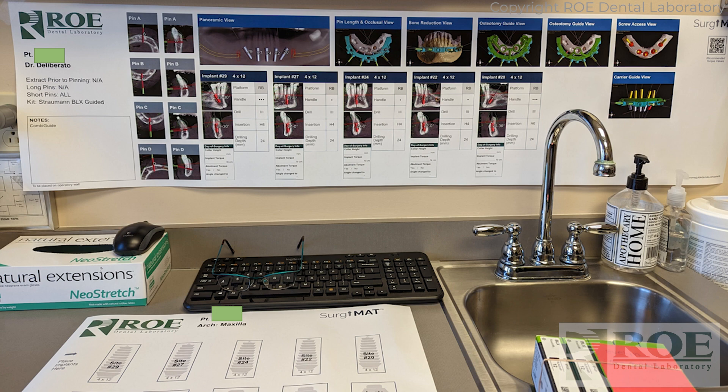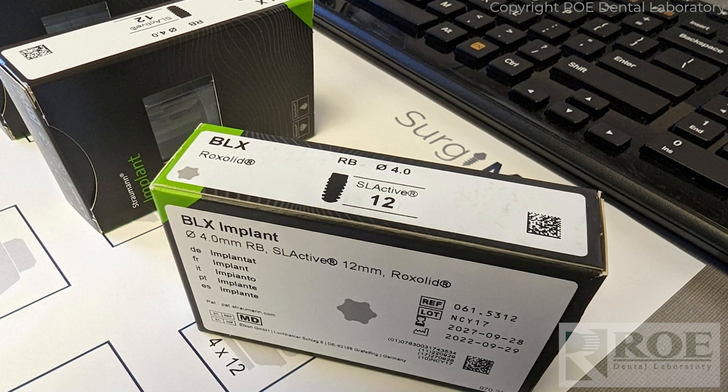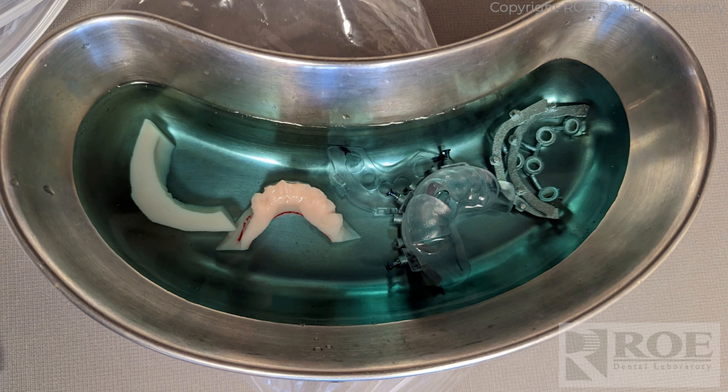The SurgyMat gives you a panoramic view and all the images of the guides and how they relate to the bone, the drilling sequence, and an area to track torque values during surgery and which pins to use. The mat part goes on the counter where you line up your implants, multi-unit abutments, temp cylinders, and the parts for surgery. In this case it was a BLX — a very aggressive implant that gives you a lot of confidence because of the initial torque it provides.